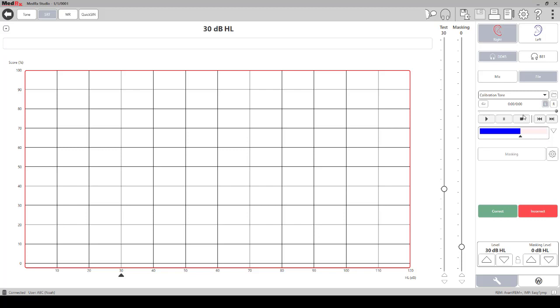A CD drive would be needed on your computer to use your own CD. There is a 1K calibration tone in the built-in files to calibrate. L and R will switch the left and right channels for CDs that were recorded that way.